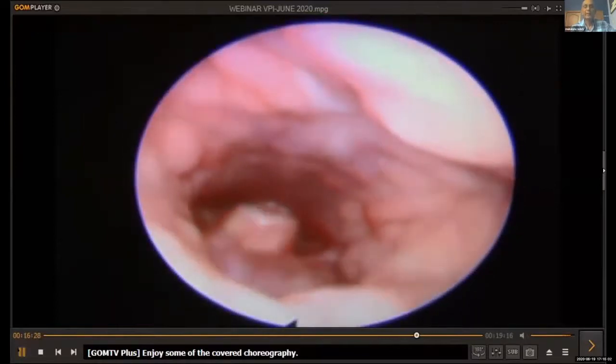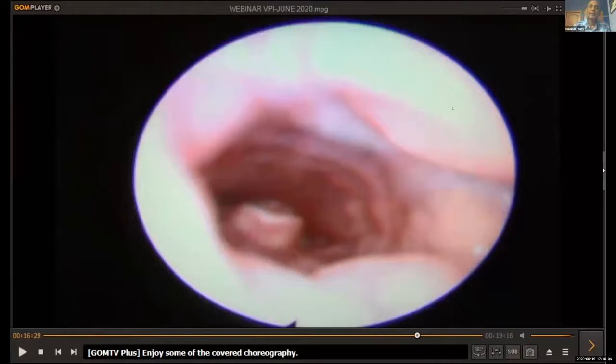I think we'll stop at that. I have some more examples, but they can wait. Thanks, Savita. Sure. You can go. Thank you, sir. There's just one question that you may quickly answer. What is the size of the nasoendoscope used? It is 2.6 to 3 millimeters that I use. I think it's 3 millimeters. Currently smaller ones are available. That's what I use.